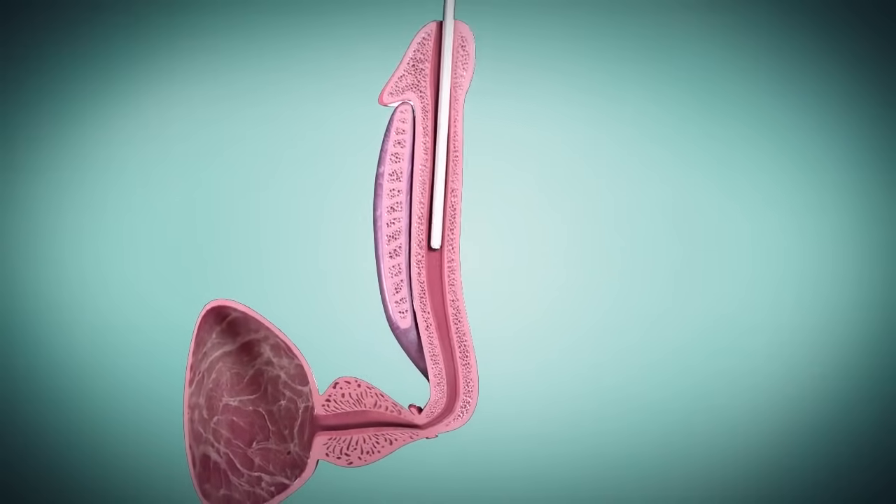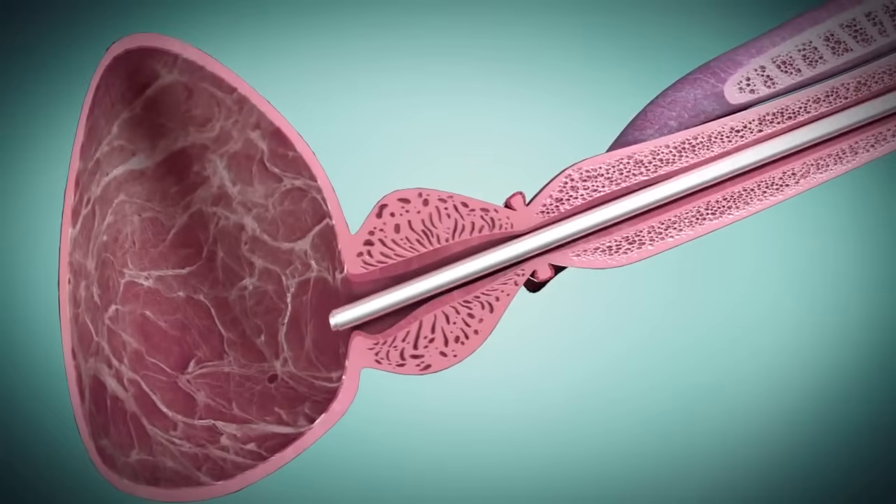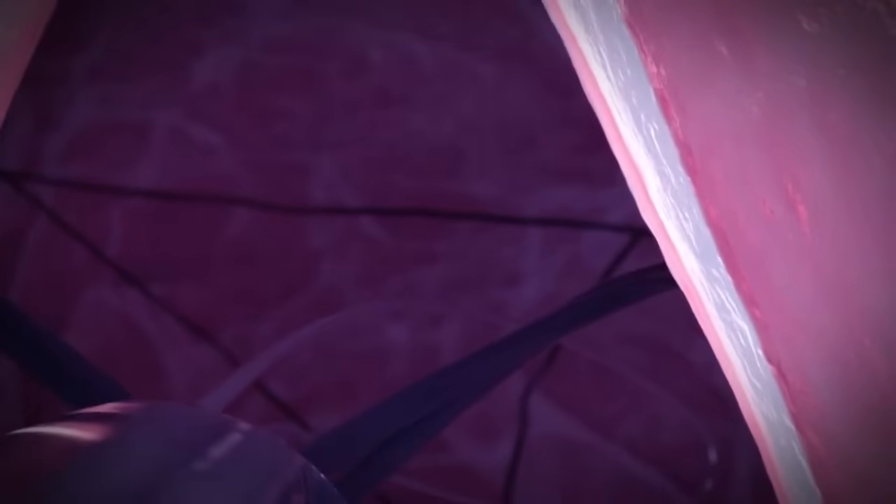First, a rigid cystoscope is inserted into the meatus and guided up the urethra until it passes the bladder neck. The ITIND device is inserted into the sheath in a crimped configuration and pushed through until it is released into the bladder.